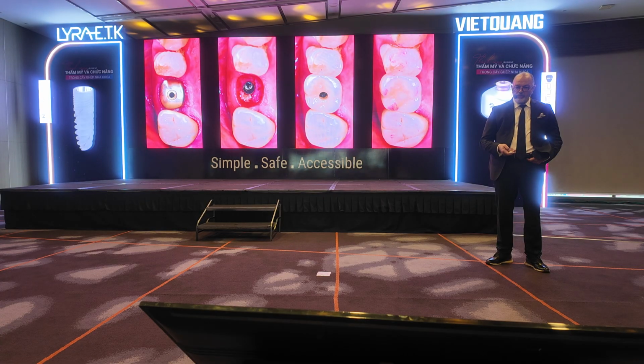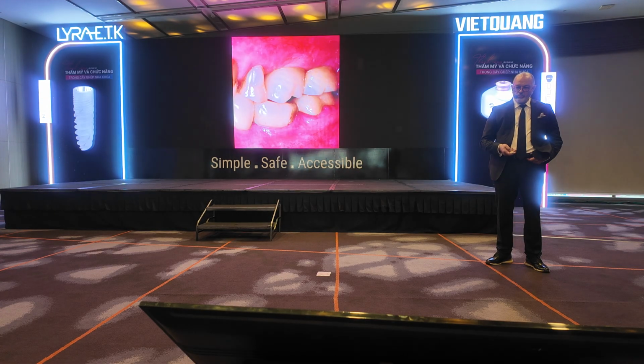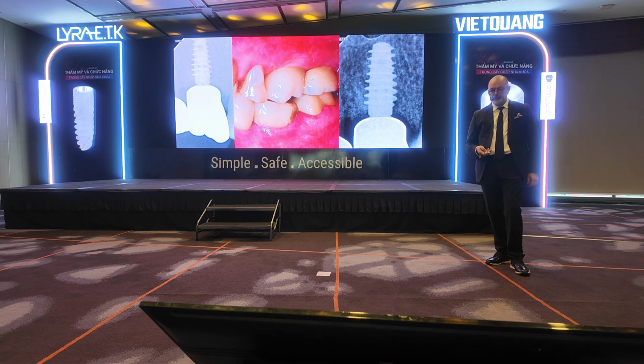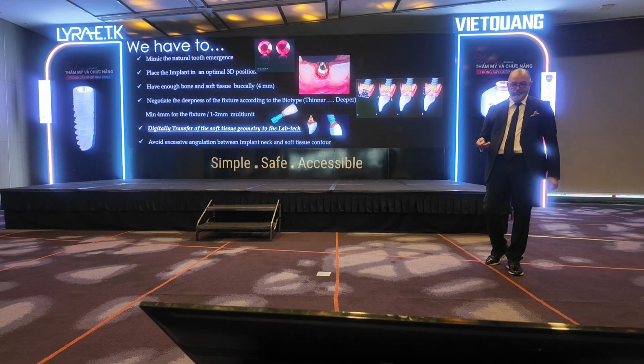You have this kind of beautiful views on the work of the lab technician. So you can see here that we are on the top of the bone, and we are absolutely not taking any space, and the body will resorb enough bone to make this very thin layer to be protected against something which is highly biocompatible because it's zirconia oxide.